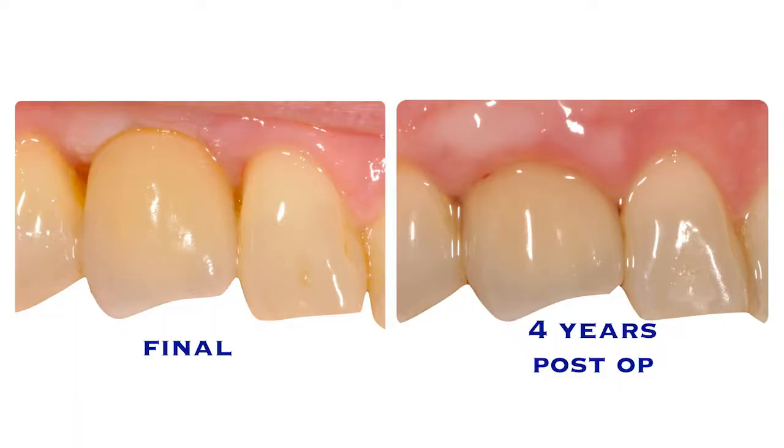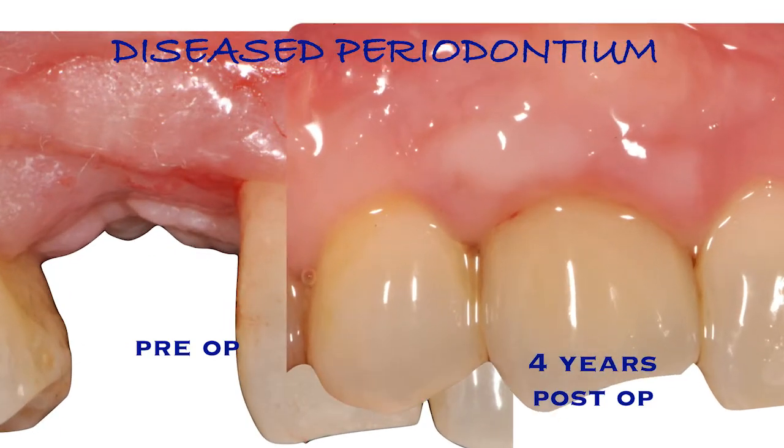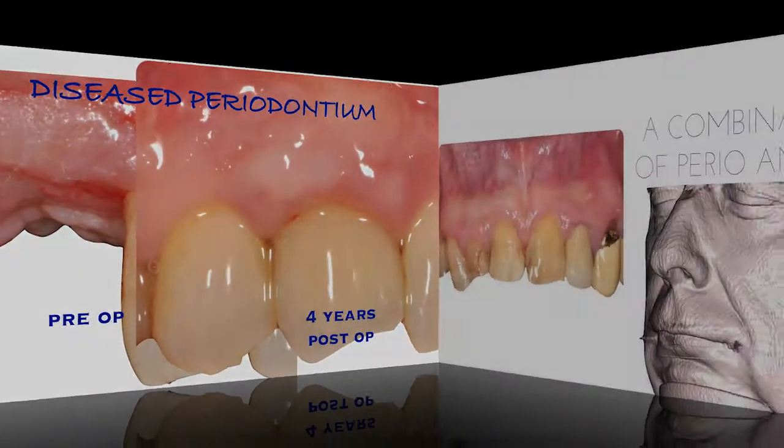I didn't perform any kind of CT graft here. It's just soft tissue manipulation. And this tissue tends to get thicker and mature after a few years. So I left this space here on purpose in order to have the newly formed papilla, which again is an optical illusion. It is an optical illusion. And that's before and after. So here, without Osstell, I would feel really, really uncomfortable in performing this kind of rehabilitation.